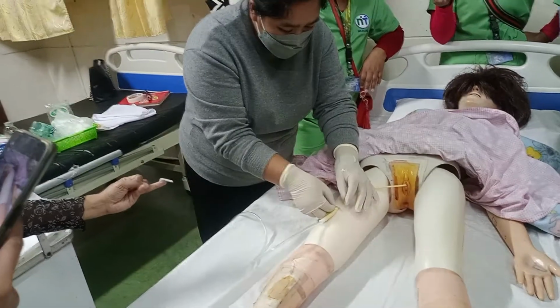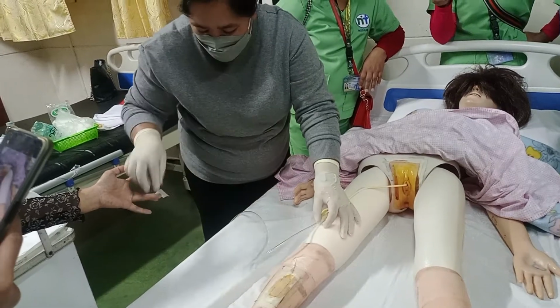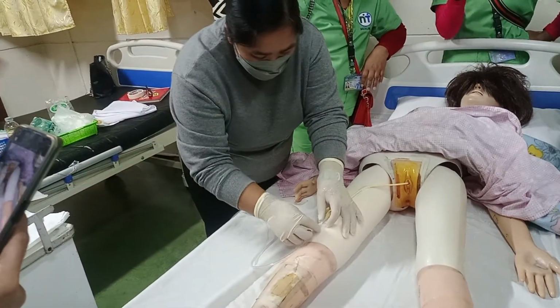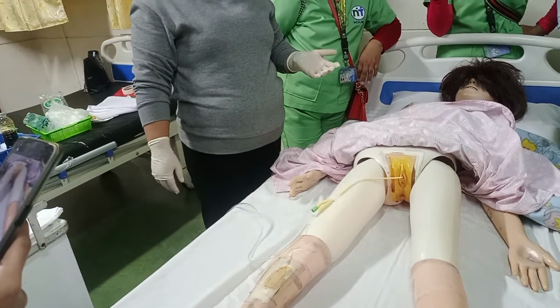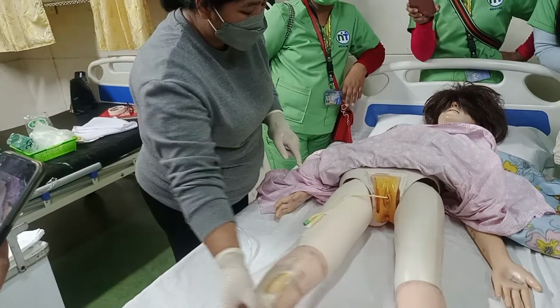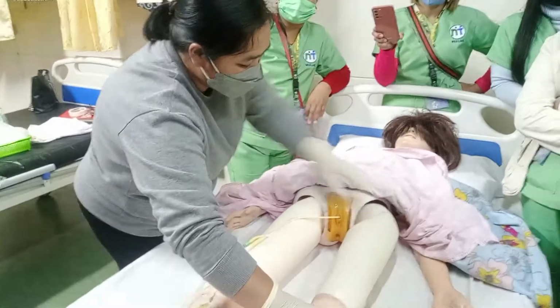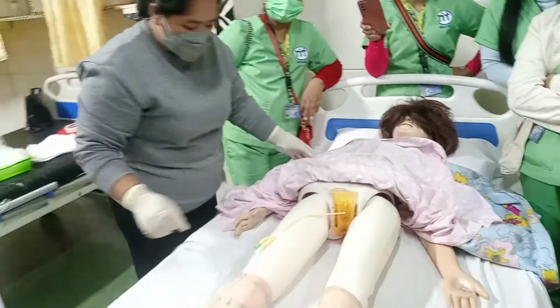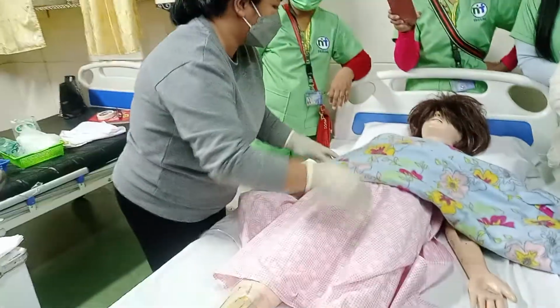Another one dito sa malapit sa Y port. And then another one dito sa urine bag, para handa nga at ginuyod. Okay? Para hindi sila maghilaan. And this one, you give this allowance para kung gaganon yung patient, hindi naman hilang-hila yung kanyang catheter. Okay? Then, after that, you're going to fix your patient.